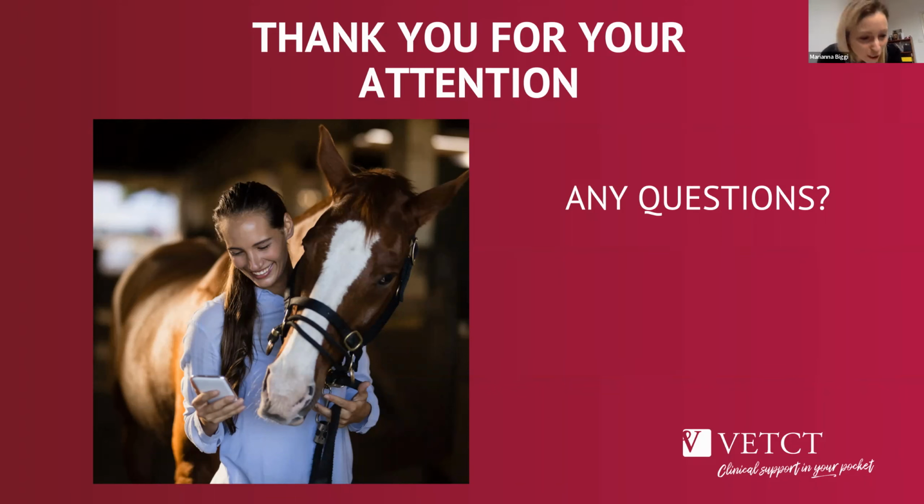Awesome. Well, I do have a question now, which is what findings will make you recommend CT versus sinoscopy? I don't really do oral examination, so I just go on the other end. So normally this has already been decided, but you mean based on my radiographic findings.